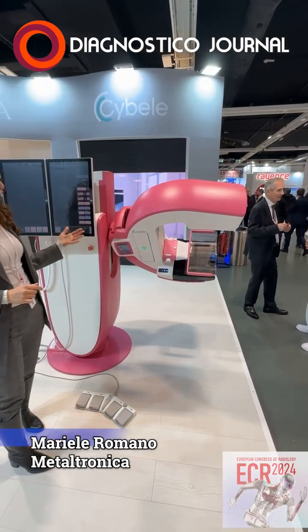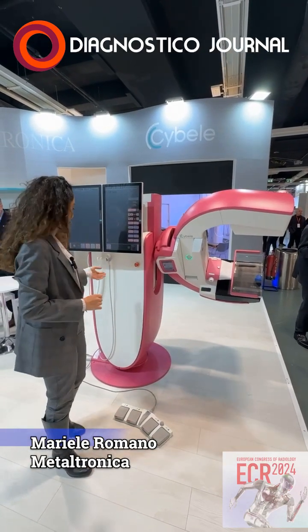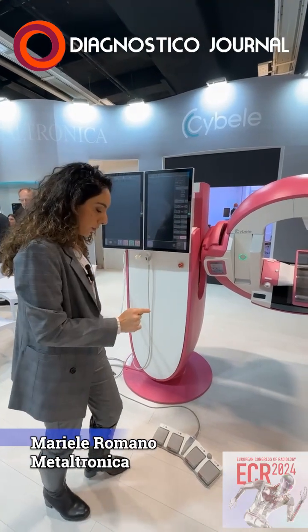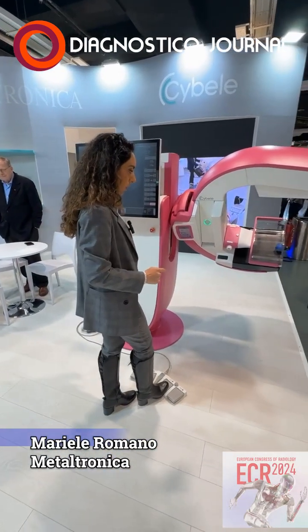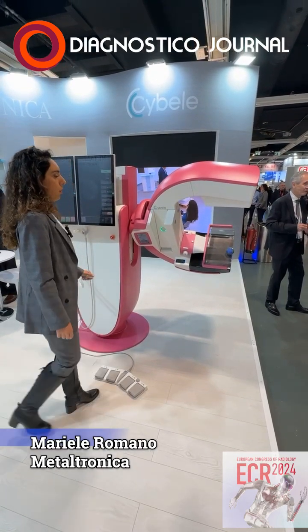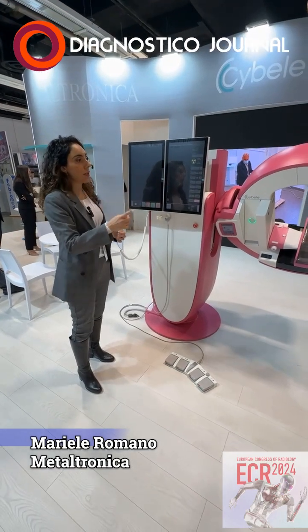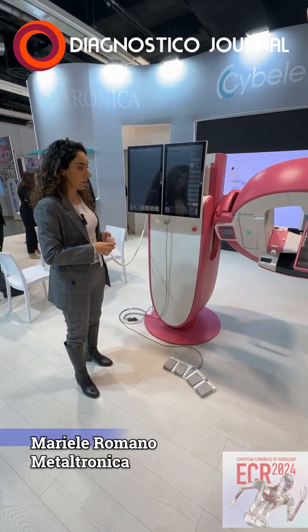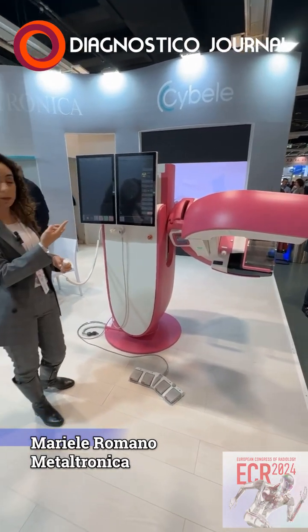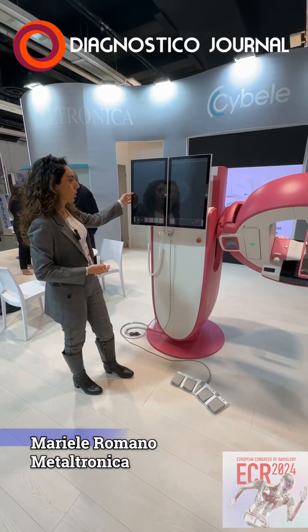So we have an isocentric rotation and the tilt moves. Once everything is ready, I have to compress the patient once more. And once I'm satisfied with the compression, I just click the X-rays and you can see the scan. After the scan is complete, the compression gets released and you will see the image showing here.